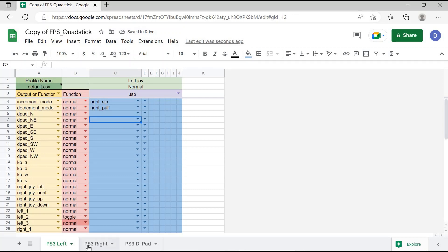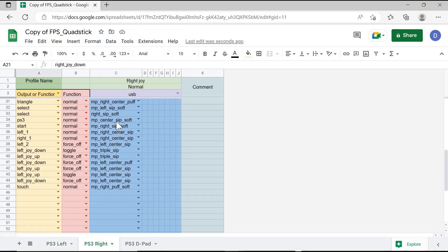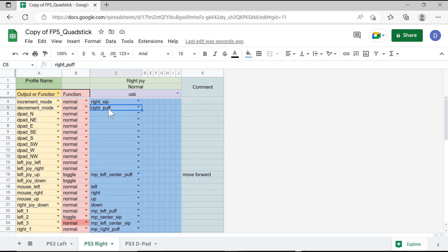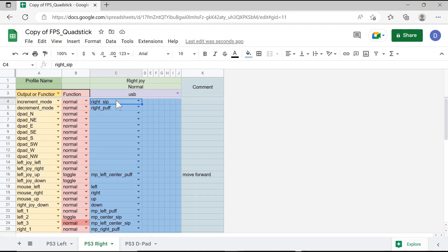Note, however, that you will have to do this on every single page within your Quadstick spreadsheet, because every page will automatically have Right Sip and Right Puff — the side tube — programmed to move between modes or pages. Therefore, for every single page, switch it to whatever input you want the user to use to switch between the small profiles or different pages on their Quadstick spreadsheets.